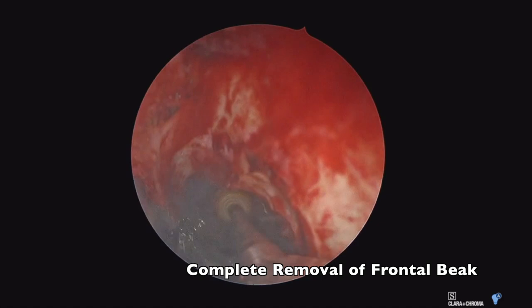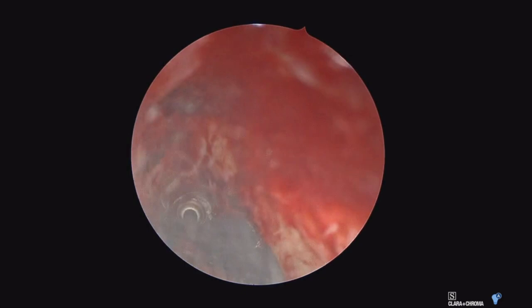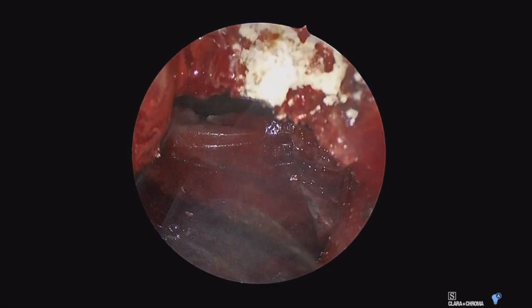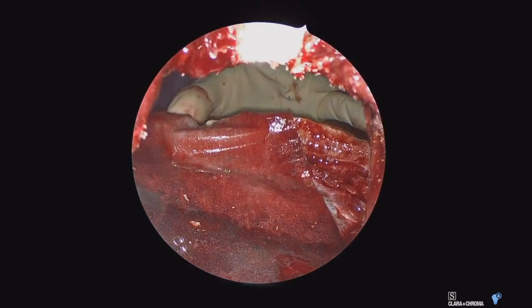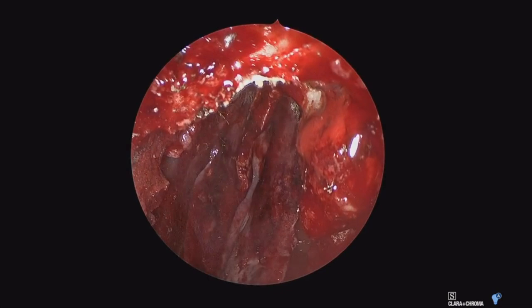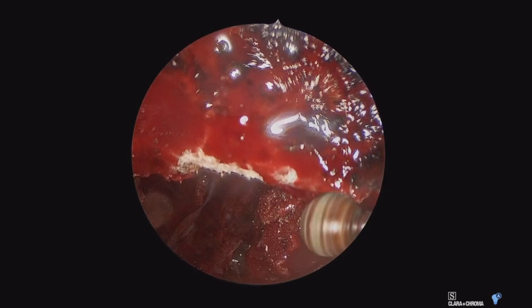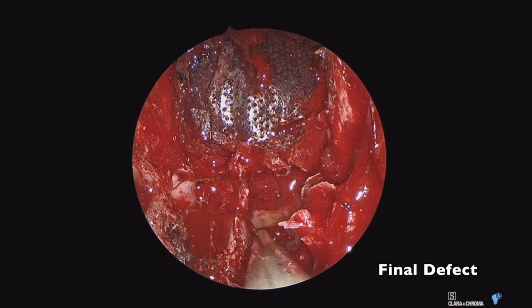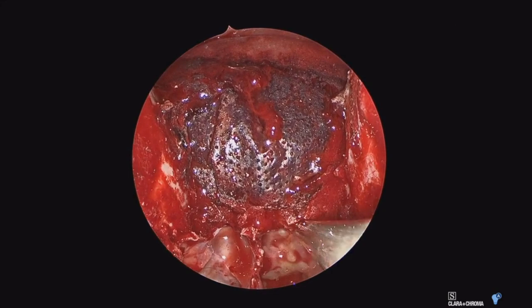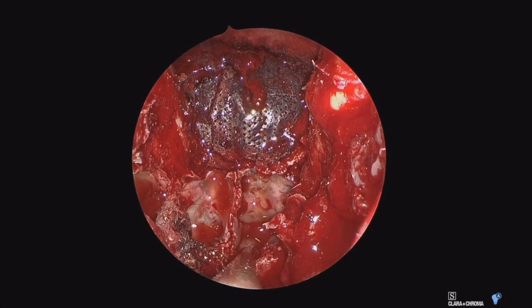Here I am drilling down the frontal beak, ensuring there's no further mucosa in that area and visualizing this region better for our reconstruction and long-term surveillance. We'll now get a combined look both through the nose and from above. After tumor resection and achieving negative margins, we begin thinking about our reconstruction. Here we are drilling smooth the anterior table of the frontal sinus to ensure our flap will lay down nicely on top of smooth bone. Here is one of the final endoscopic views prior to reconstruction — you can see both sphenoids, the planum, the Telfa from above through our craniotomy defect, and what will become our new neo-frontal sinus after cranialization.